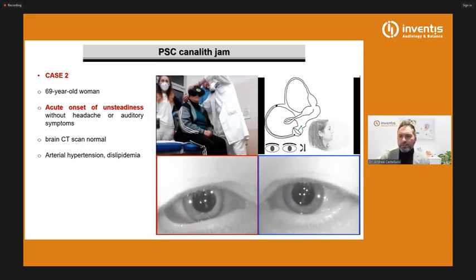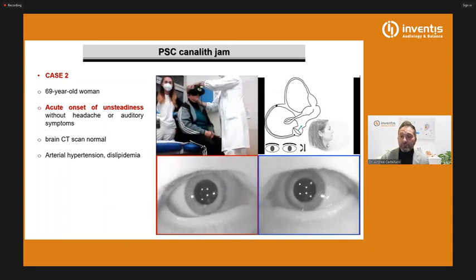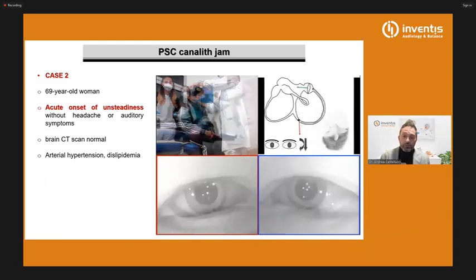Now I'm still vibrating to see if there was a strong convergence or something different. We also use the head shaking test. Of course, head shaking, mastoid vibrators, you can see now the increase of spontaneous nystagmus with the head shaking.